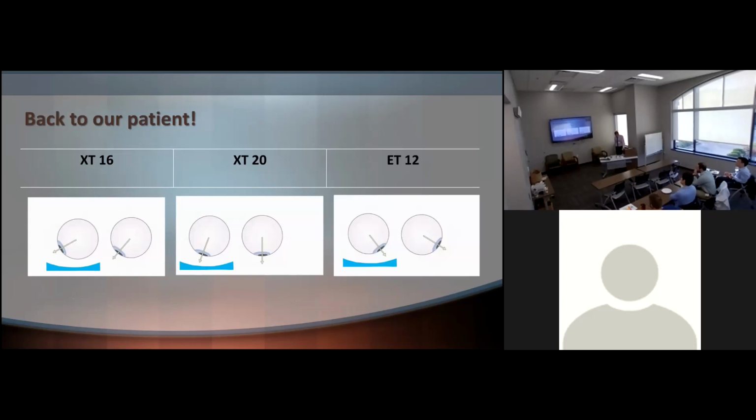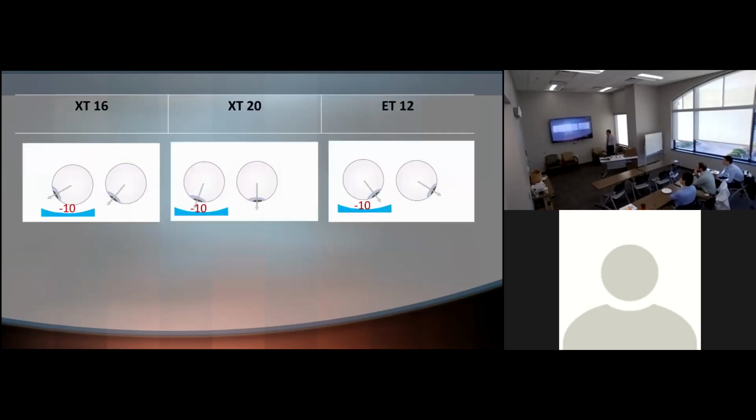Okay, after this long journey, let's go back to our patient. Almost done with the lecture. We measured 20 prism diopters in the primary gaze, 16 in the right gaze, and ET of 12 in the left gaze. Remember the first impression? Let's analyze this. The patient is looking through a -10 thick biconcave lens. Let's say the patient is looking 12 millimeters away from the center of the lens on the right gaze and 12 to the left.